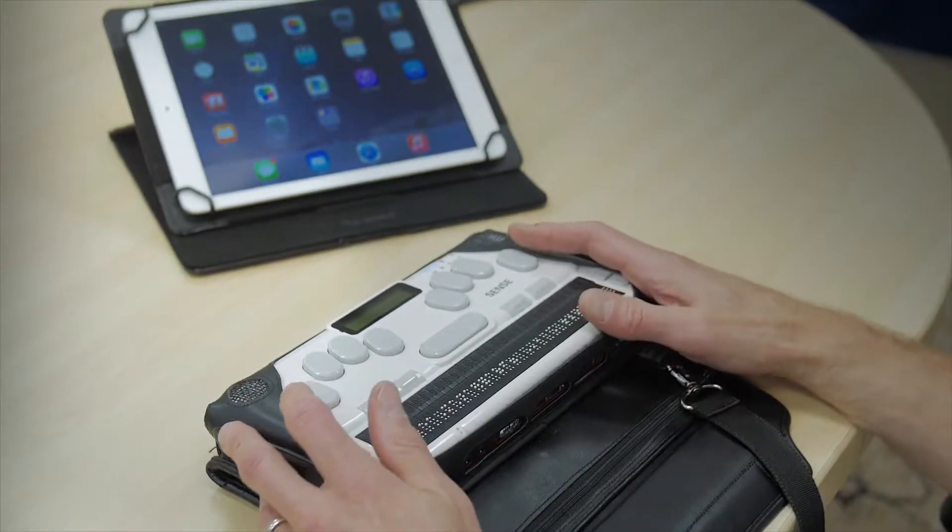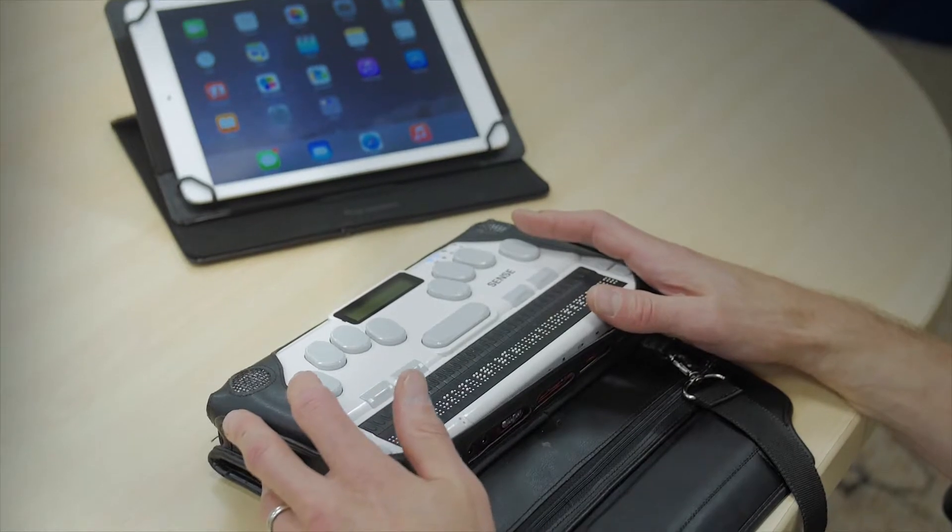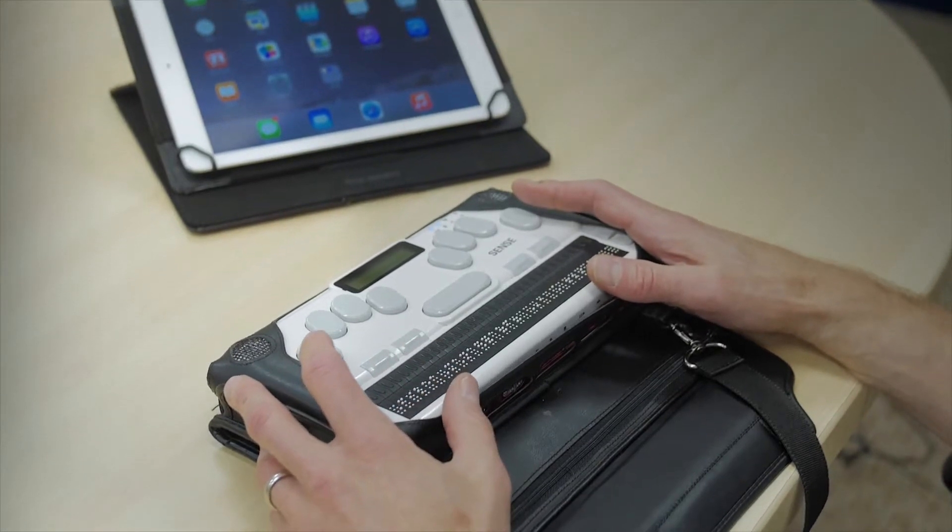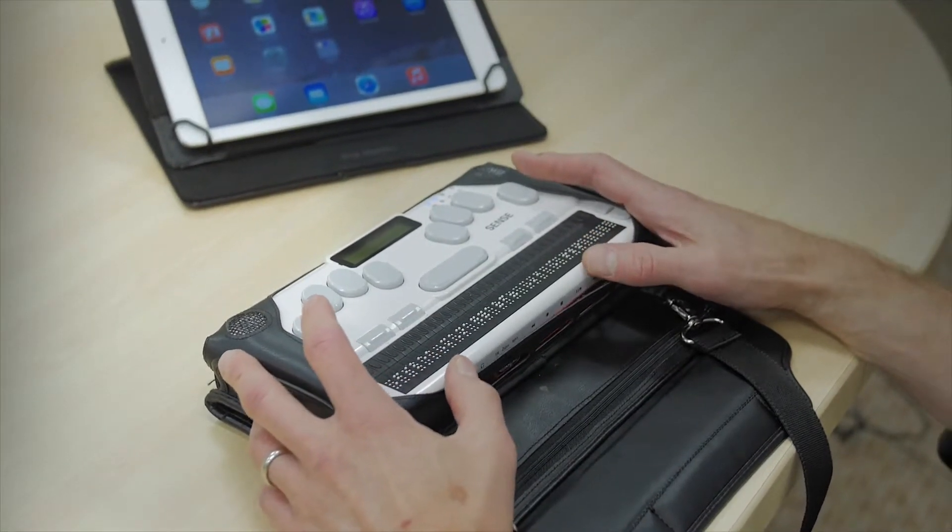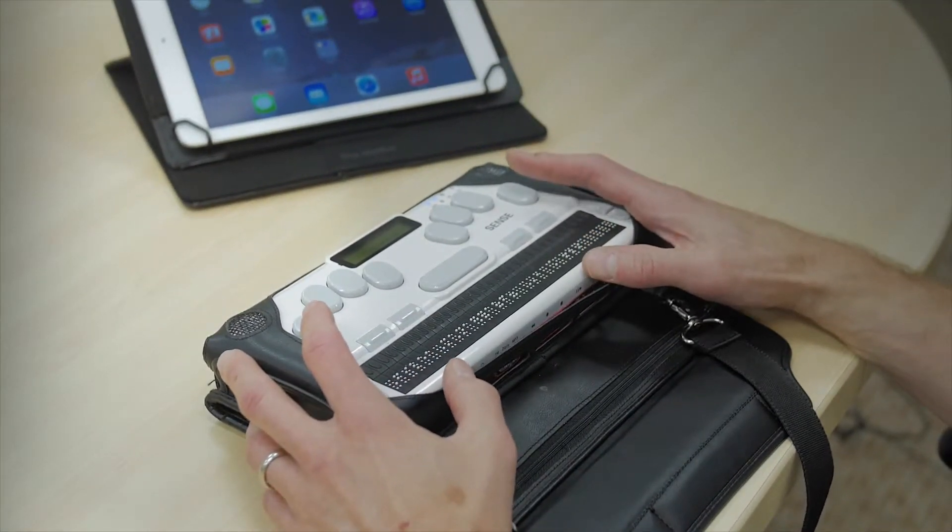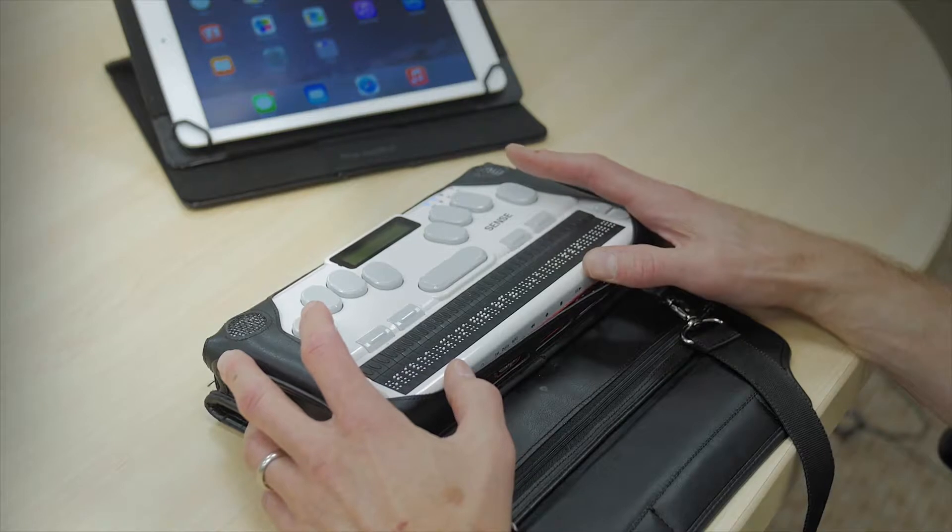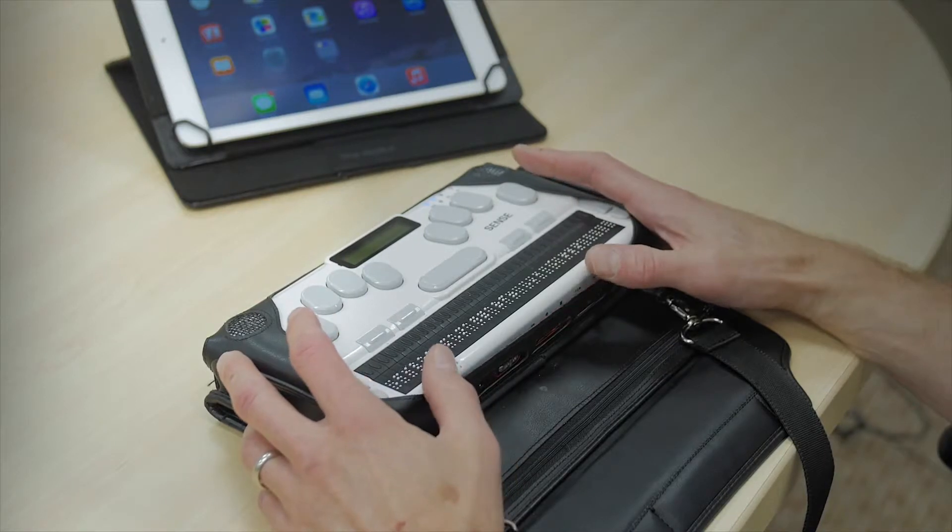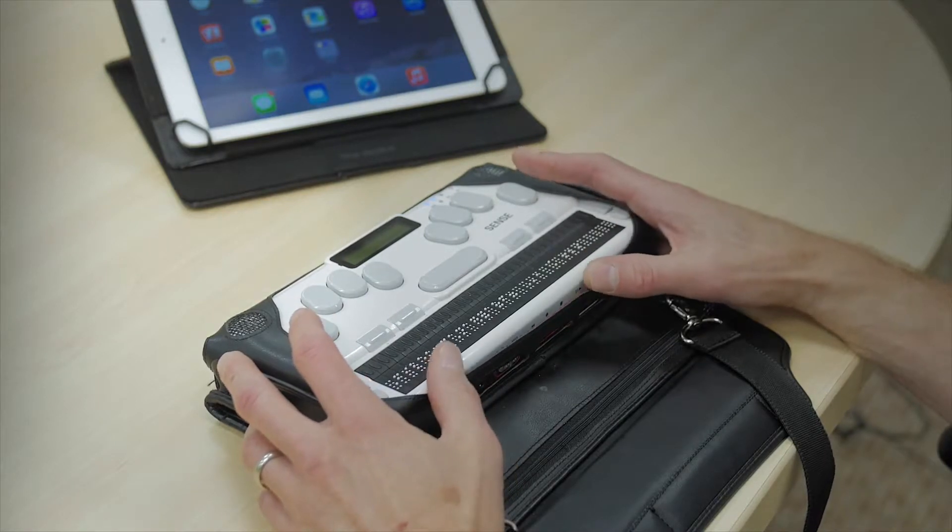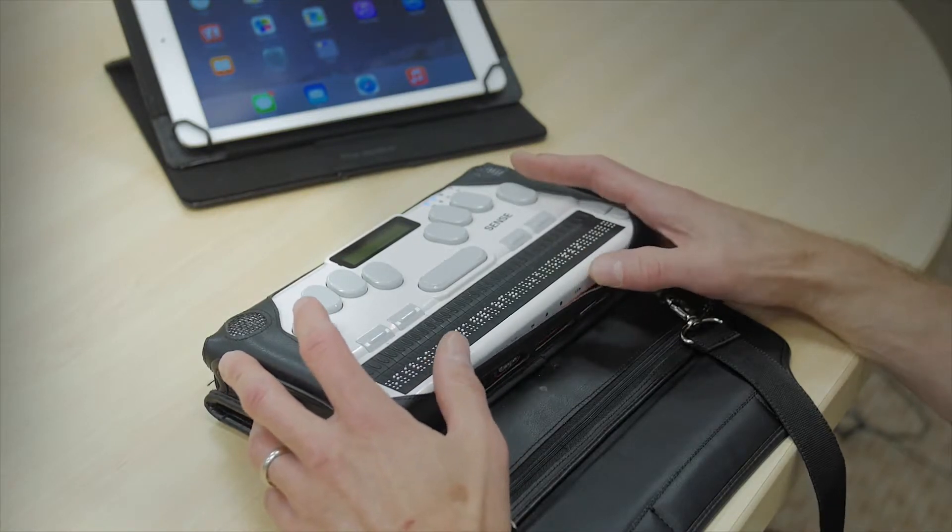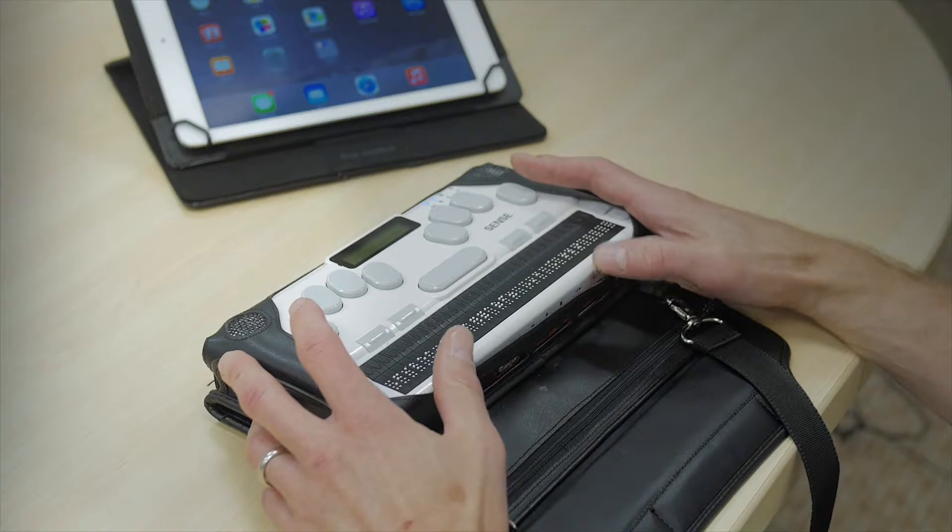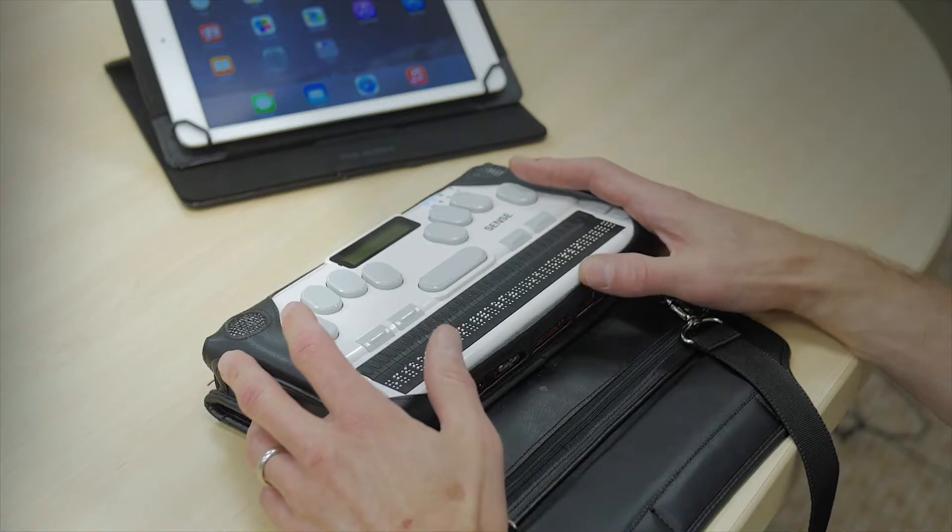The first part of this pairing is going to be done from the BrailleSense side. The BrailleSense will automatically turn Bluetooth on if you don't have Bluetooth on when you go into the terminal for screen reader, so you don't have to do anything as far as those settings go.